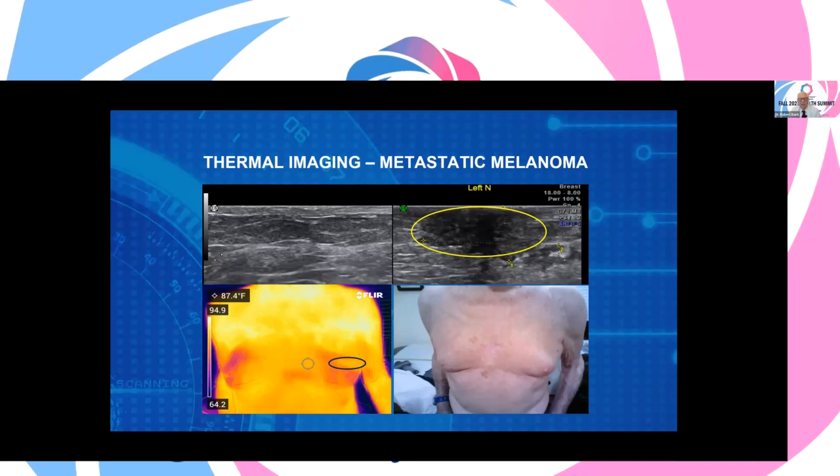With melanoma, the second you put the blood flow on, it lights up like a light bulb. This is how we tell how aggressive, say, a melanoma is, or almost any cancer. The more blood vessels, the more aggressive. And this is used specifically in melanoma skin cancer detection globally to tell the patients how aggressive the melanoma or any other cancer is in the moment.